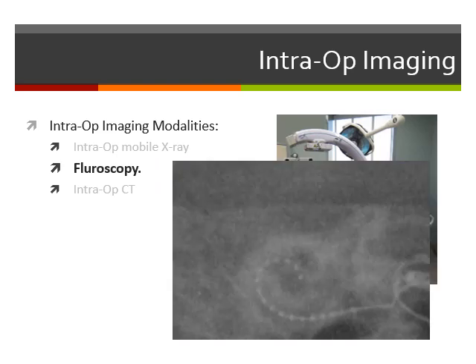And if I have a more magnified picture like that, I can even see, look here, this is the superior semicircular canal. If I make a vertical line like that, all the electrodes medial to that line are considered inside the cochlea, because this line represents the site of the cochleostomy or the round window. If I find some electrodes lateral to that line, I can count them as outside the cochlea. Okay?